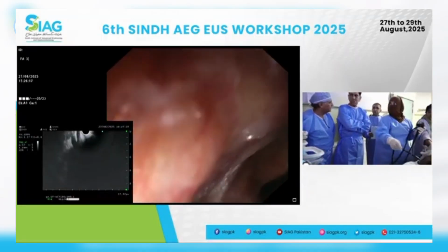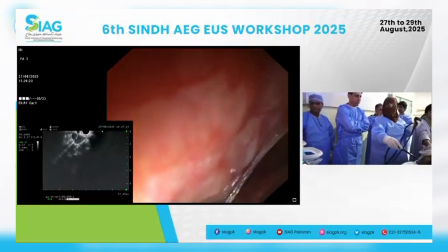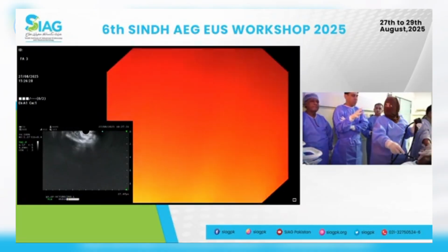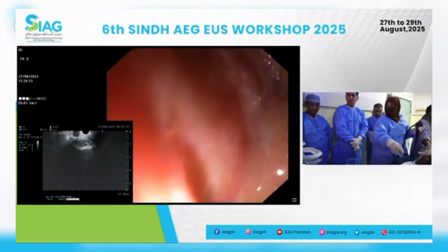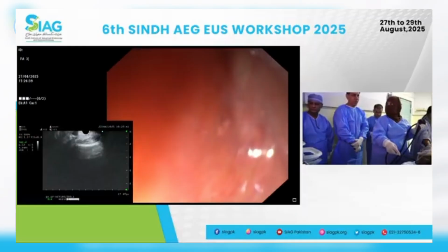It's okay, that's fine. Big wheel up. So tip down when you reach the posterior oropharynx, then you tip away, or big wheel away from you. Good. Okay, so gently advancing.